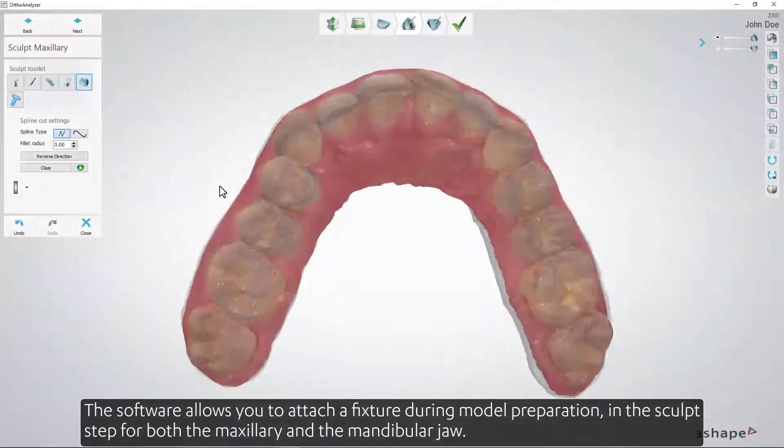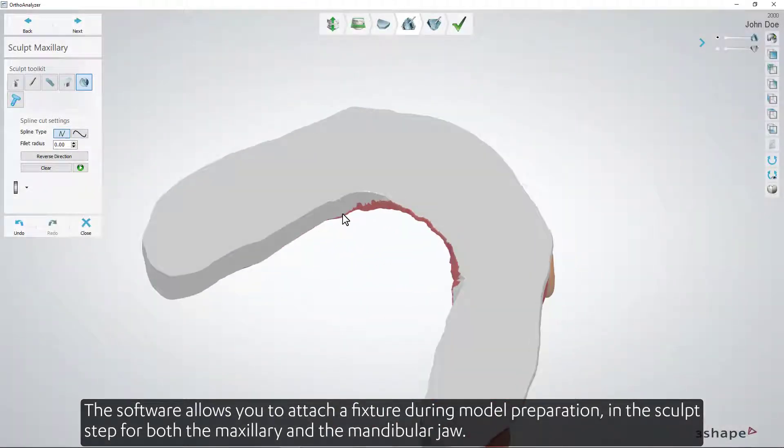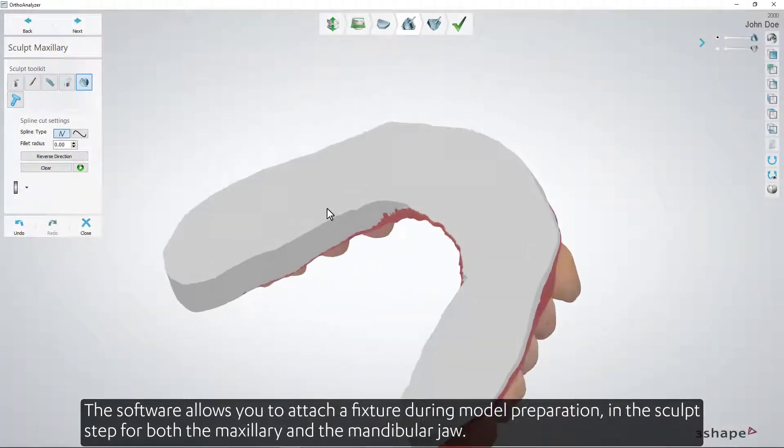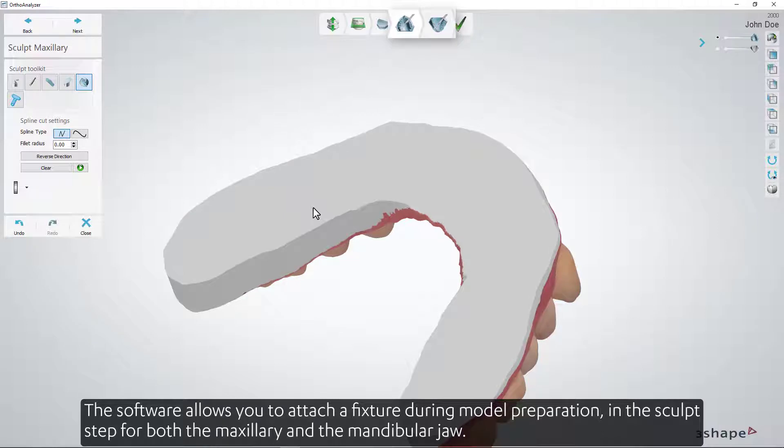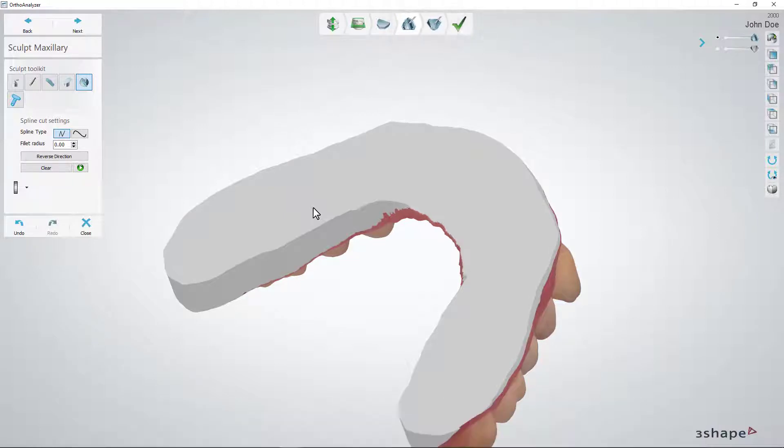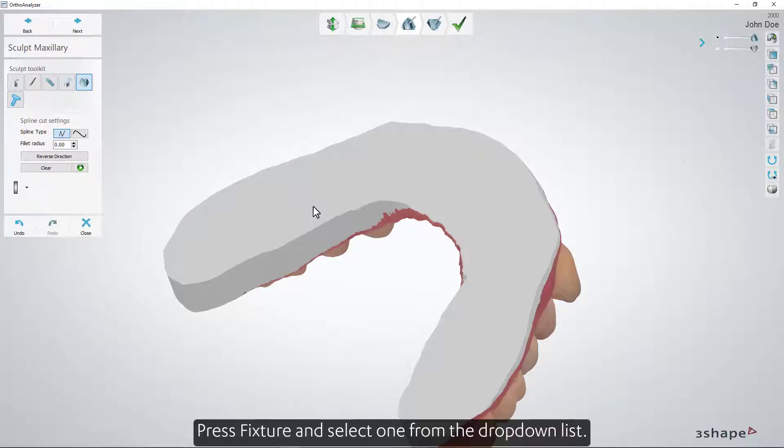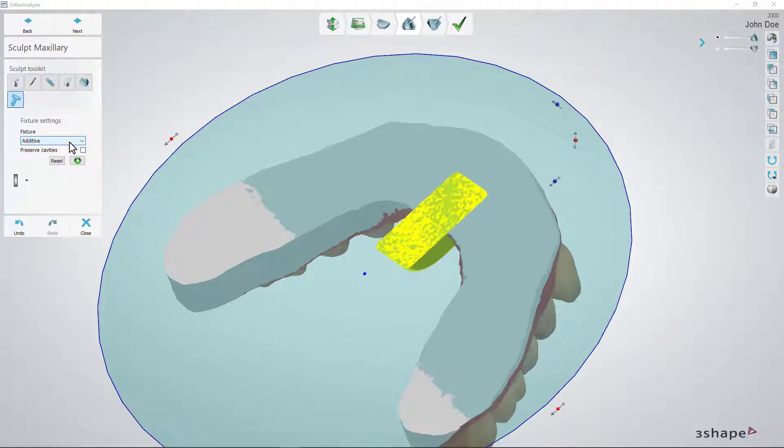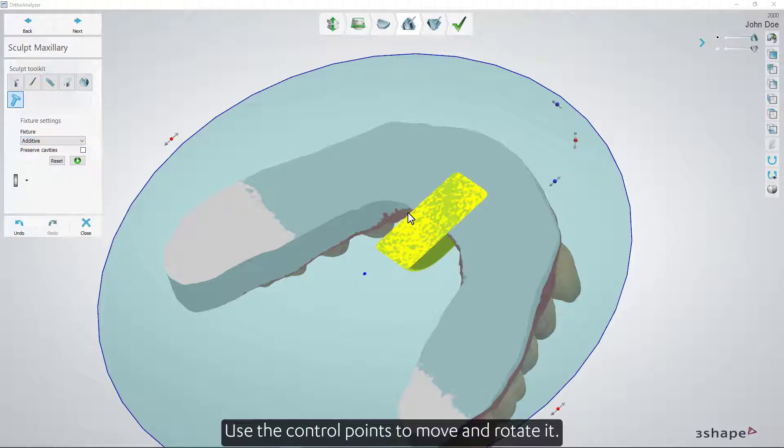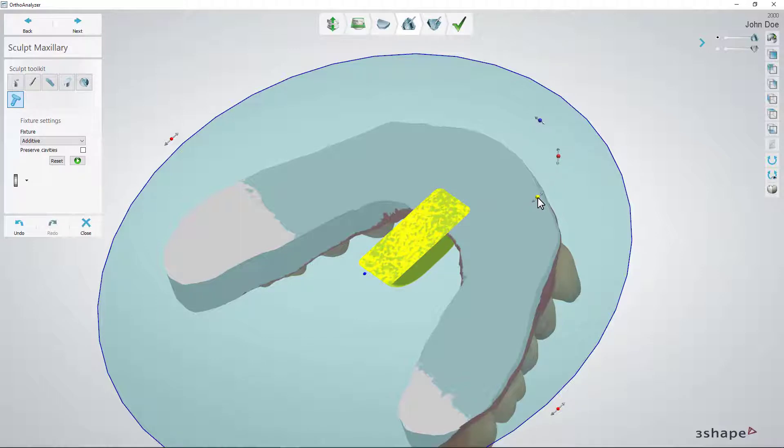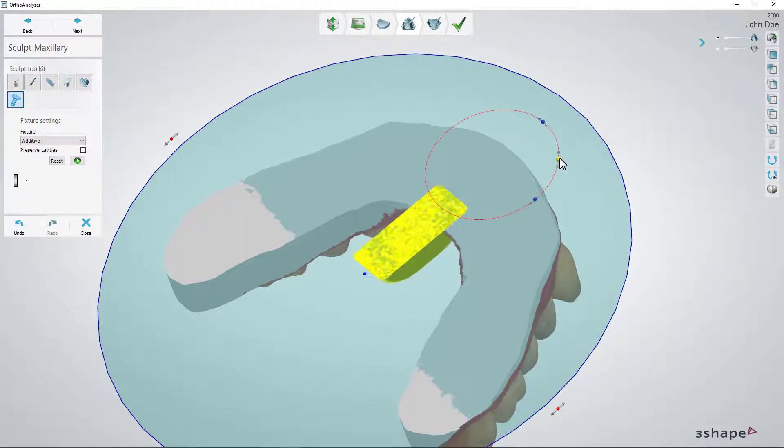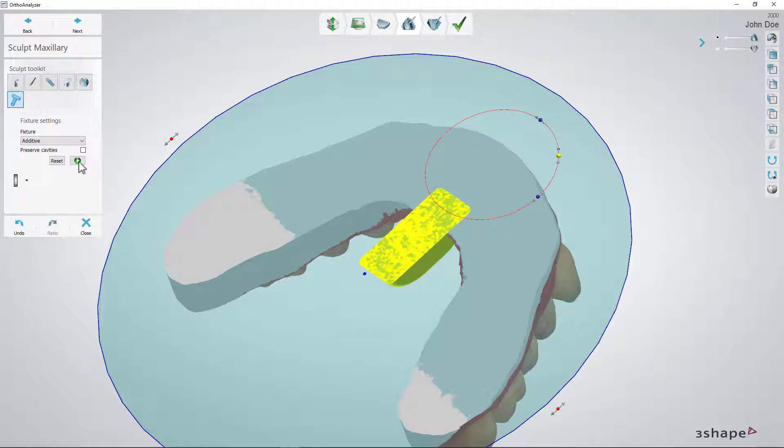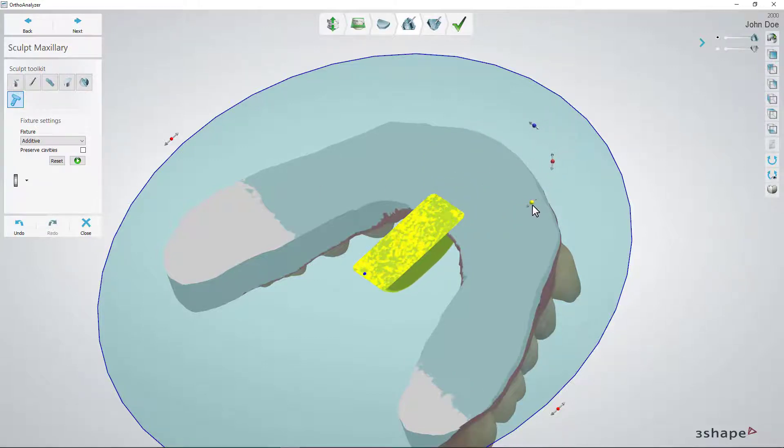The software allows you to attach a fixture during model preparation in the sculpt step for both the maxillary and the mandibular jaw. Press Fixture and select one from the drop-down list. Use the control points to move and rotate it. Press Apply.